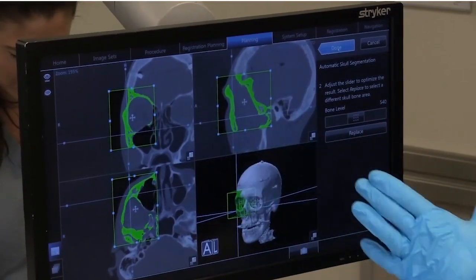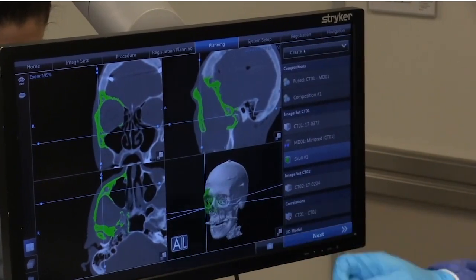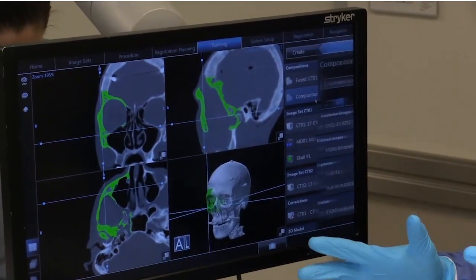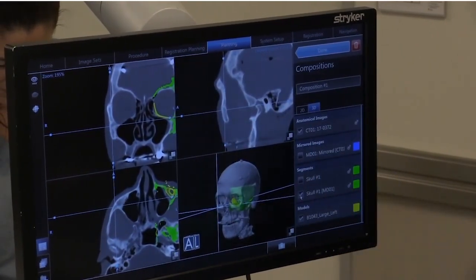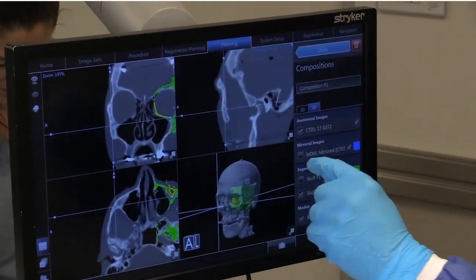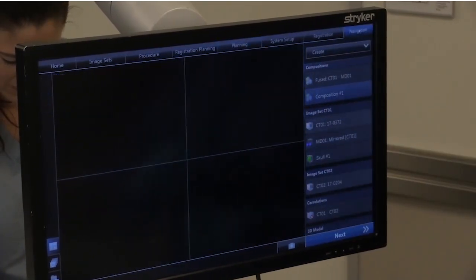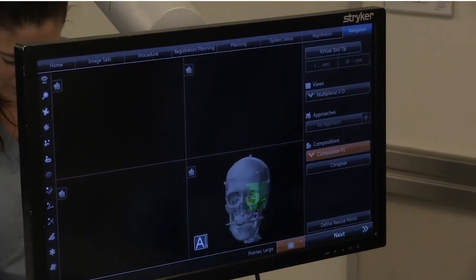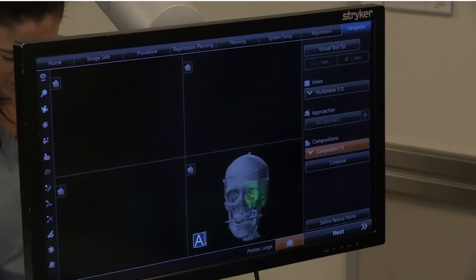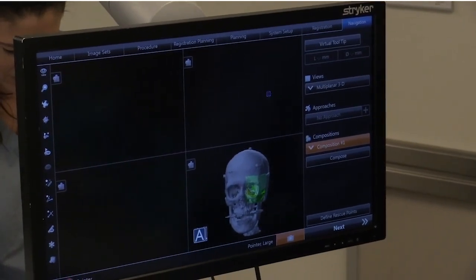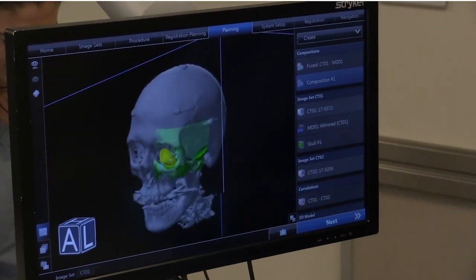Now we've captured all this anatomy, and we're going to define what anatomy we want to pick out. The computer picks based on threshold segmentation — the Hounsfield unit density of the structure — to determine what it wants to mirror. You click on the bone, it highlights the bone, and then you create your mirrored image on the opposite side. You'll see it automatically aligns the mirror image structure on the opposite orbit, and in this case the mirroring is actually quite accurate.